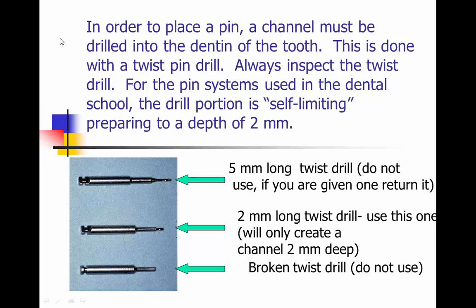In order to place a pin for retention, we must drill a channel into the dentin of the tooth using a twist drill. Always inspect the twist drill to make sure it's in good working order. Here we see three examples of twist drills: the top one is 5 millimeters long — don't use that, it's too long and makes placement much more difficult. Typically we use the 2-millimeter long twist drills in the middle; they create a channel about 2 millimeters deep to allow us to put a self-threading pin into that channel. You may also be given a twist drill with the drill tip broken off — throw that one away.